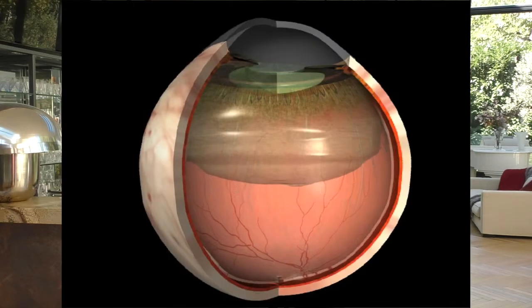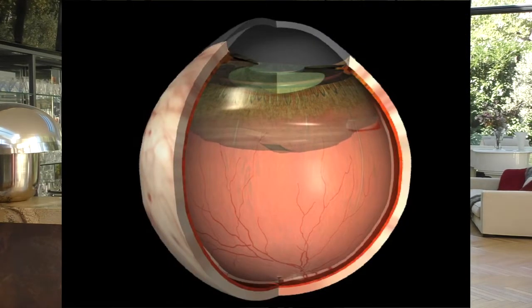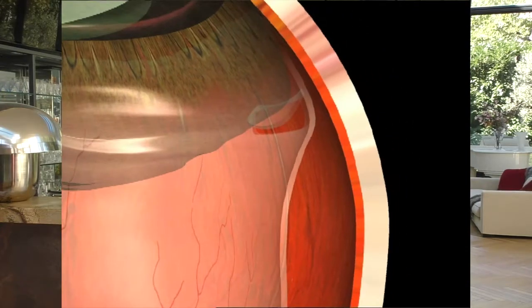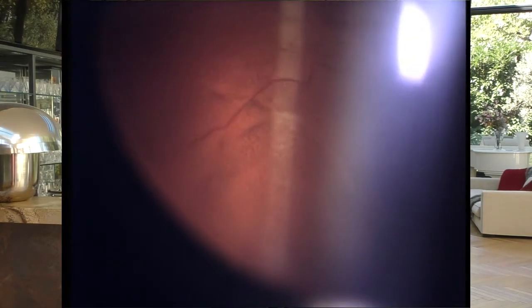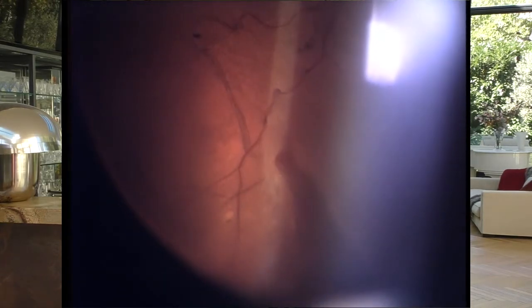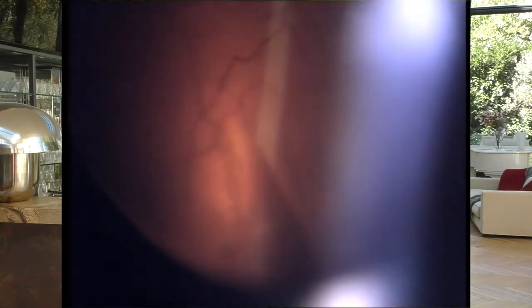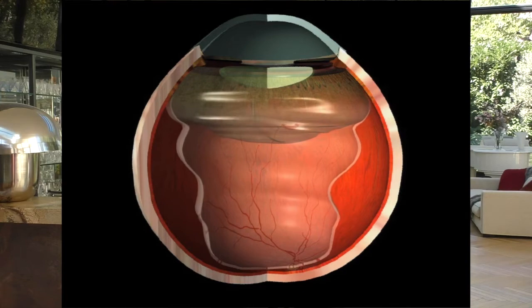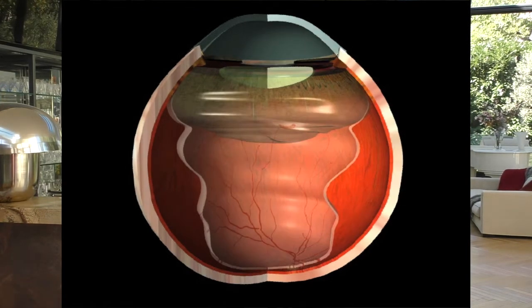This indentation will be the more recommended as the tear will be located at the vitreous base with static traction, because not only is vitrectomy at that level more difficult, but also because the indentation will then relax the vitreous base and have a preventing effect on recurrences. Same thing if there is a small circumferential retinal fold.